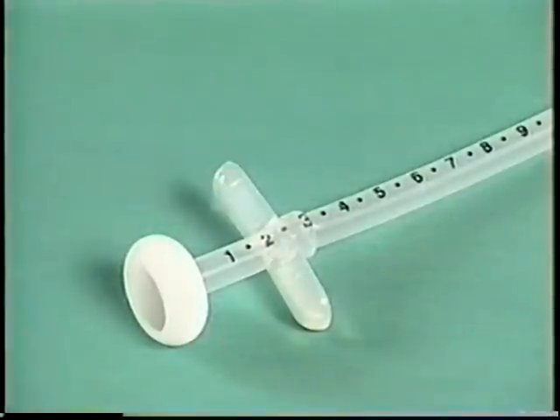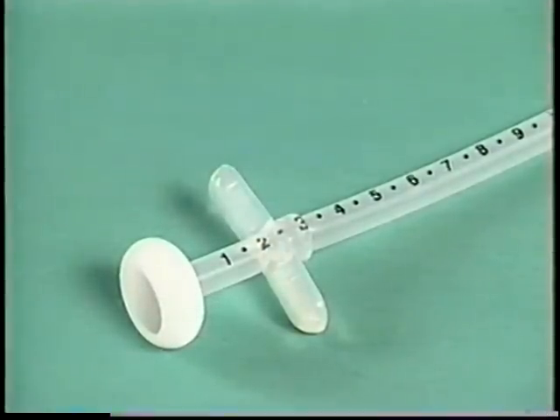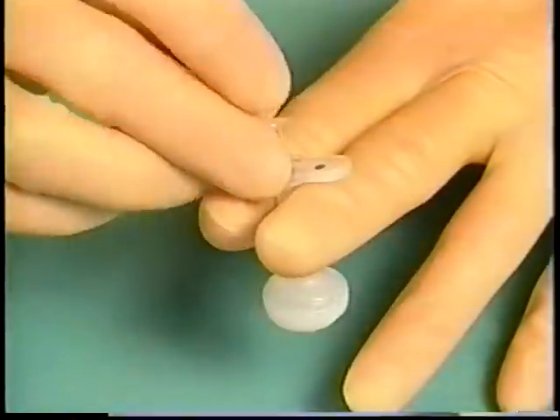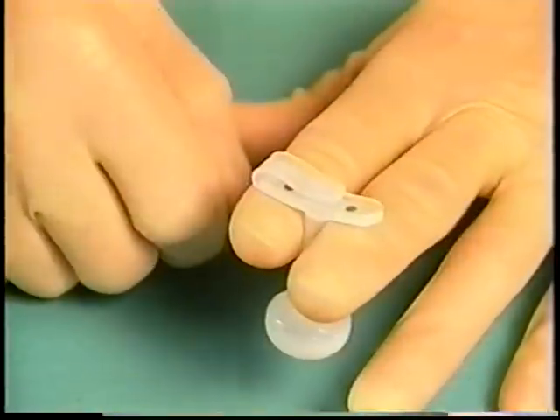The external section of PEG tubes also comes in two options. With the first option, the tube extends out from the patient. The second design is referred to as low profile because the entry port for the PEG is integral to the external bolster and is therefore very near skin level.